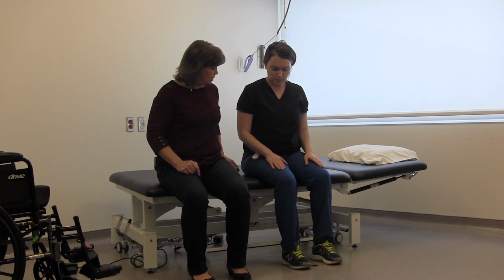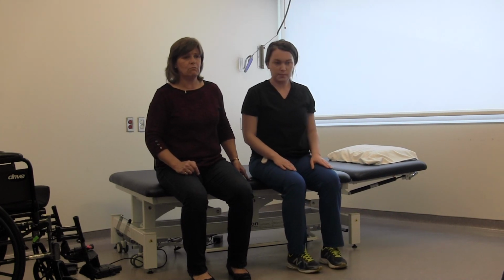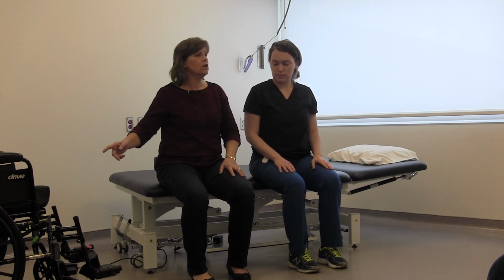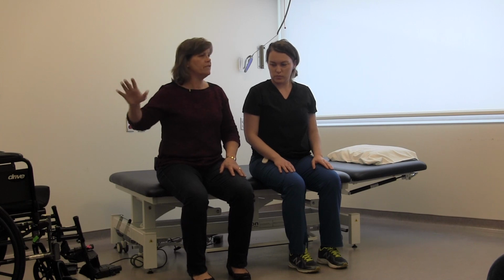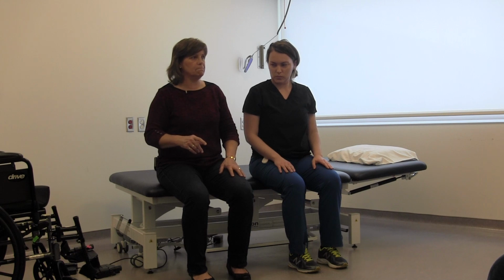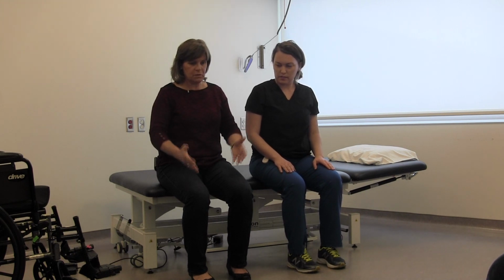So I want you to come over the course. Come right to the edge. Right to the edge. And when we actually do the transfer, when the patients are in the chairs, typically what I tell people is bring their hips forward of the large wheels of the chair. And then they'll be in a good position. Okay? So the next thing to think about is feet position.